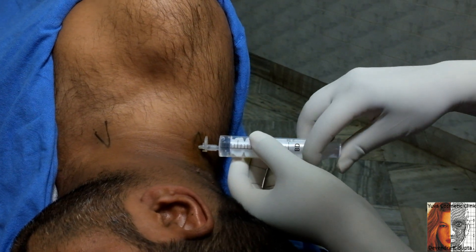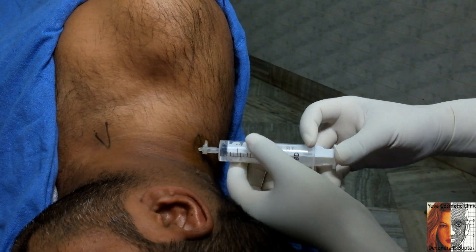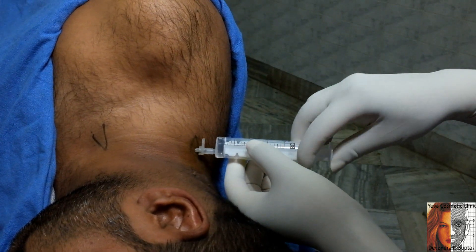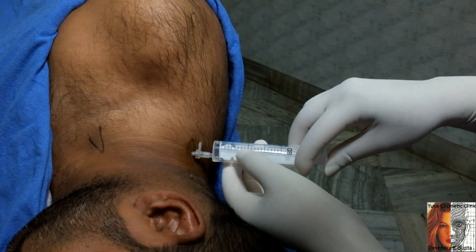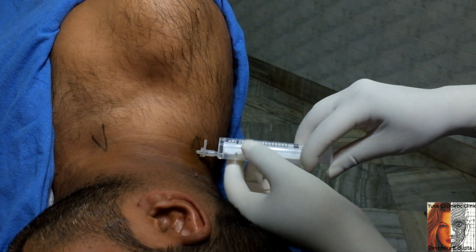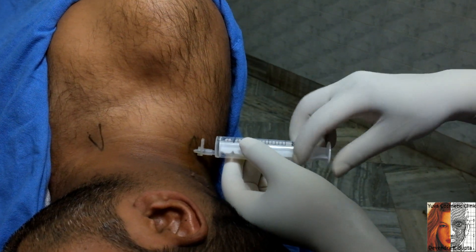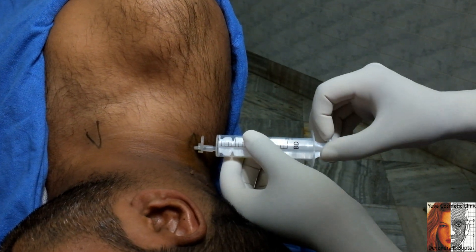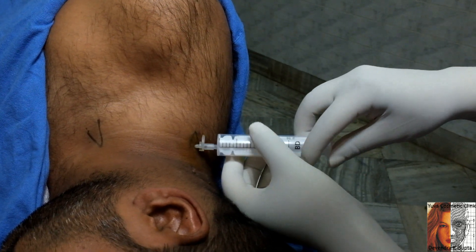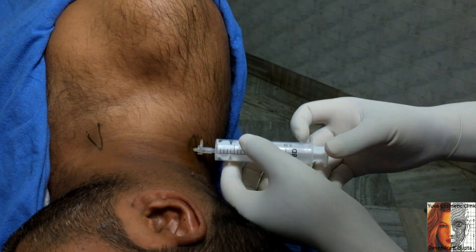The result of the sympathetic block is long lasting. The limb becomes warm after this injection. After 10 to 20 minutes you can notice the dilatation of the vessels and warmness of the limb. During this, we will ask the patient to exercise extensively to relax the muscles and mobilize the joint.